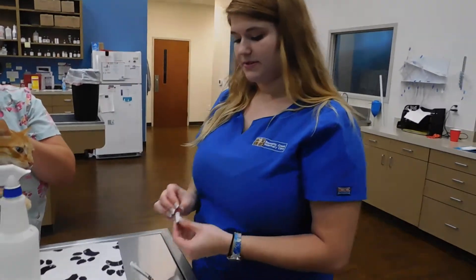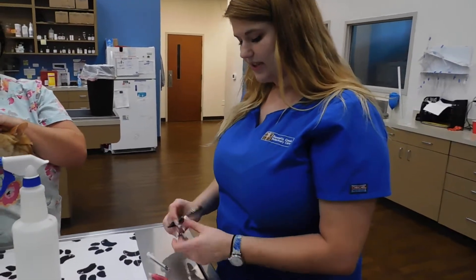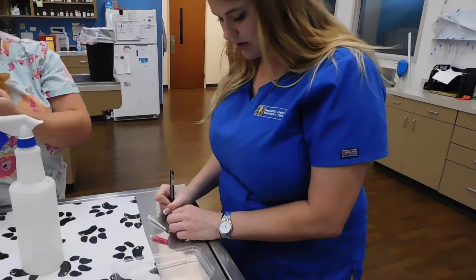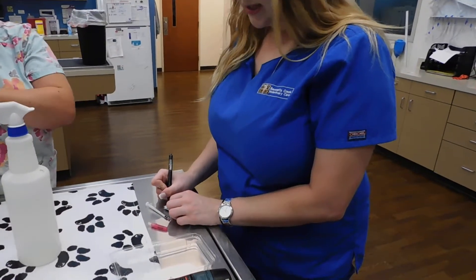We're just going to invert it a few times because we don't want the sample to clot — that's why we used an EDTA tube. We're going to go ahead and label this sample with the cat's name and the date. And that is it.